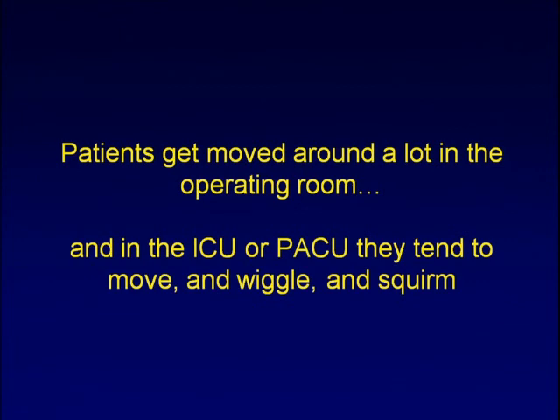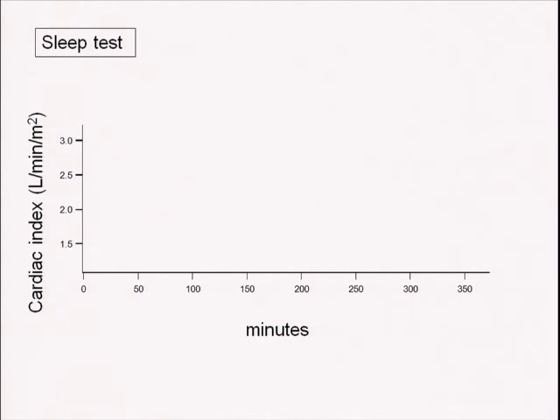But, okay, so I've kind of convinced myself that maybe it works in a laboratory setting, but what about in the clinical environment where we all work? And I'd like to progress on in using these things postoperatively. And the truth is that when you're talking about electrodes stuck in the chest, people move. And they wiggle and they squirm and the stuff falls off and you go to check your data and it's gone. So one of the first things I did with this was I actually put it on myself, knowing that at night I wiggle and I squirm. I put the electrodes on, I hit the button, and I went to sleep.